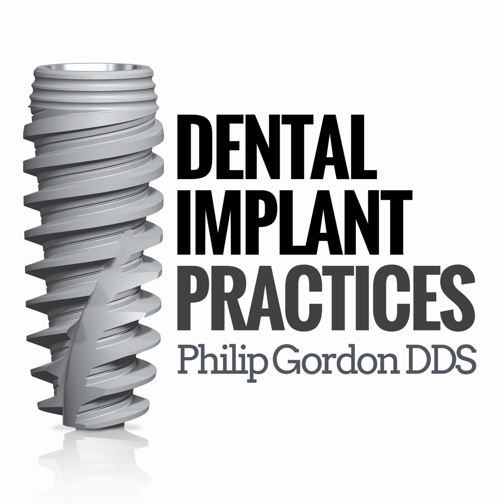Then we'll need, of course, the bite sent in to us. We'll need the models again, and then our photo series. Those 5 things: the RX, the bite, the scan with the bite, the models, the photos. Those are the 5 things we need to go forward. And that's all basically the records appointment. And we're doing our preparation, getting everything ready, sending it all to you.